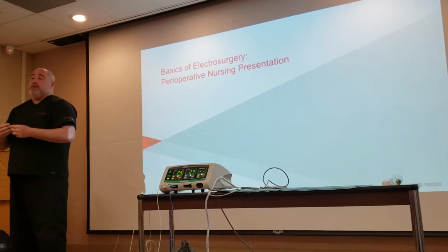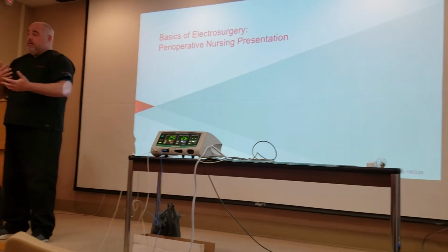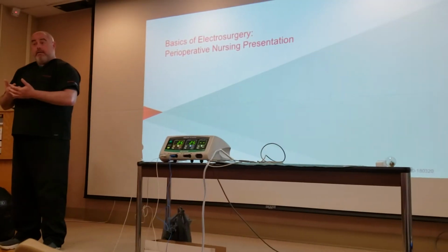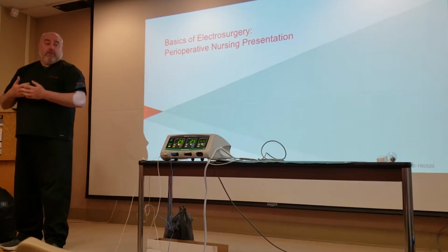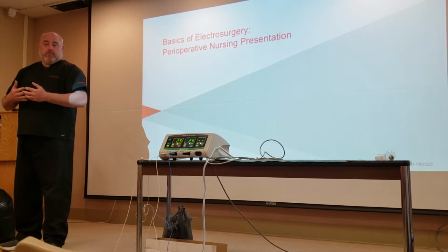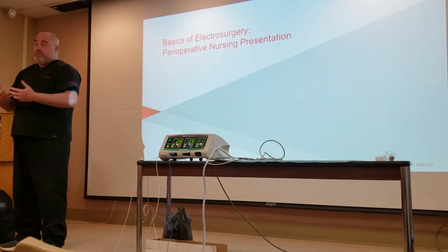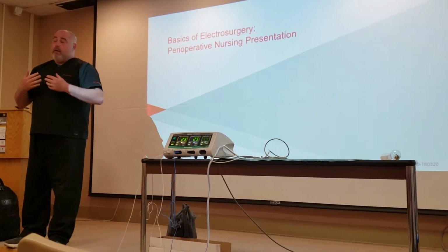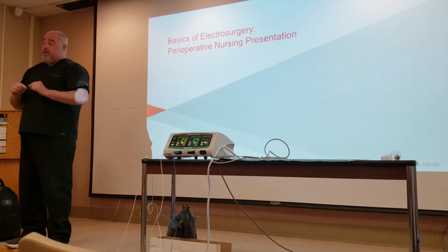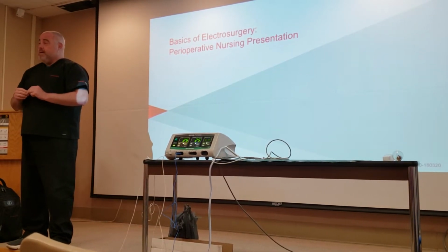Electrosurgery is actually using electricity itself, where the patient has electricity typically passing through it to achieve a tissue effect. And those are the big differences. So some semantics, but I think they're important because the terms are very, very different. And the proper term for what we're talking about today, and why we're going through all these safety considerations, is because we do use electricity with the patient, okay?